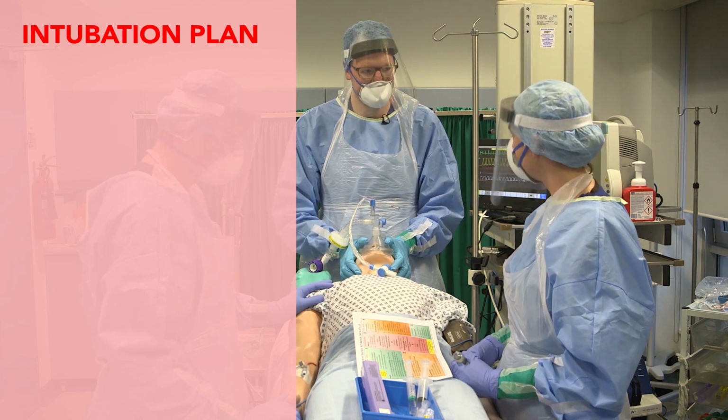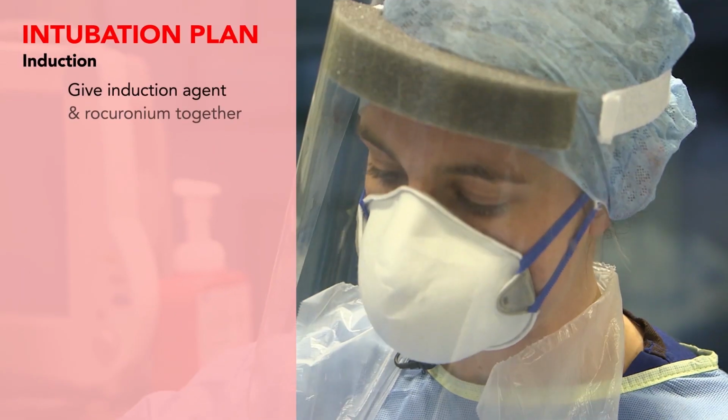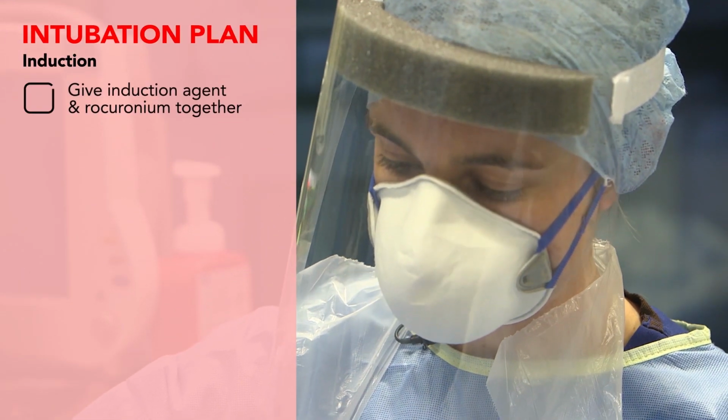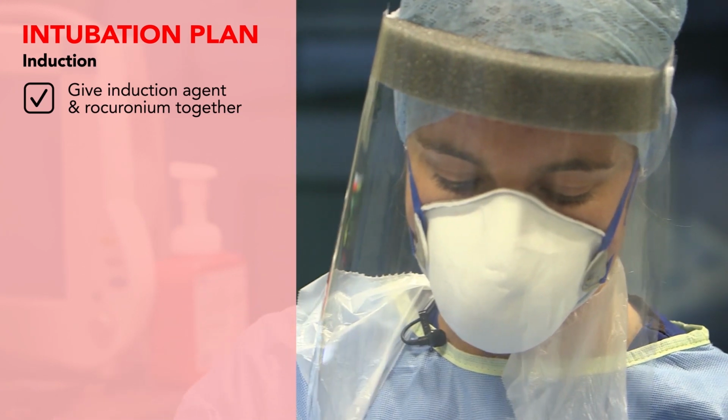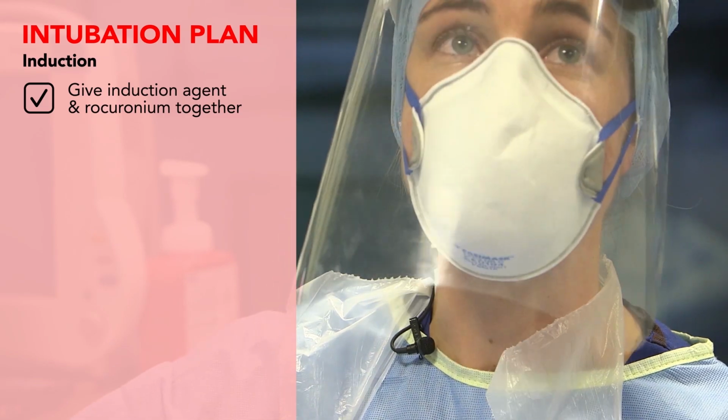Okay, if everyone's happy, you're happy to give the induction agent. Yep, so induction agent going in. I'm going to give 100 milligrams of rocuronium. And I'm just going to flush that in now and we'll start timing for a minute now.